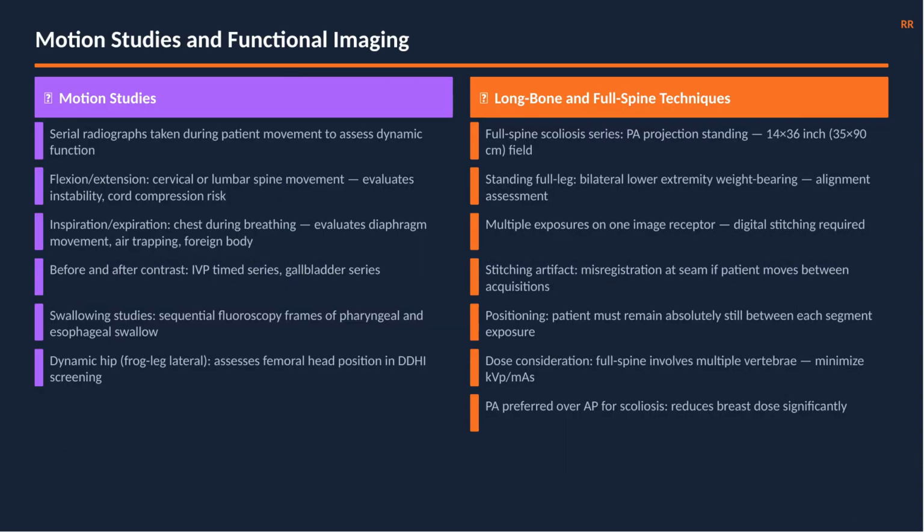Motion studies, serial radiographs taken during patient movement to assess dynamic function. Flexion and extension of the cervical or lumbar spine. Evaluates instability and cord compression risk.